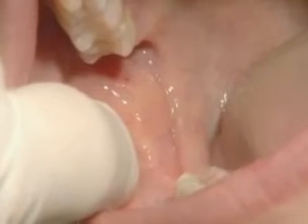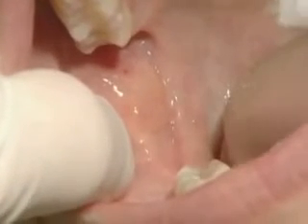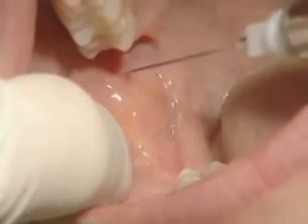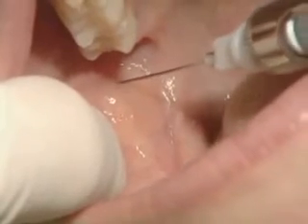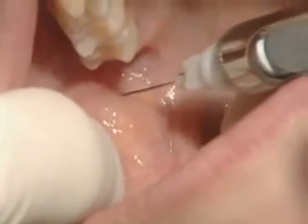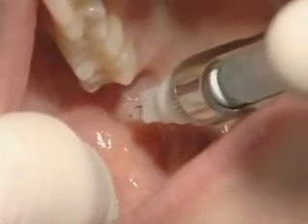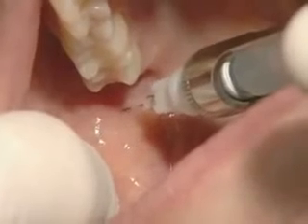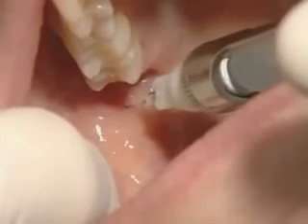Palpating the lateral landmarks — just open really wide. The syringe is going to approach from the opposite side, going below the mesopalatal cusp of the second molar. The needle is advanced 25 millimeters until you hit bone. Back off slightly, aspirate, and then slowly inject.